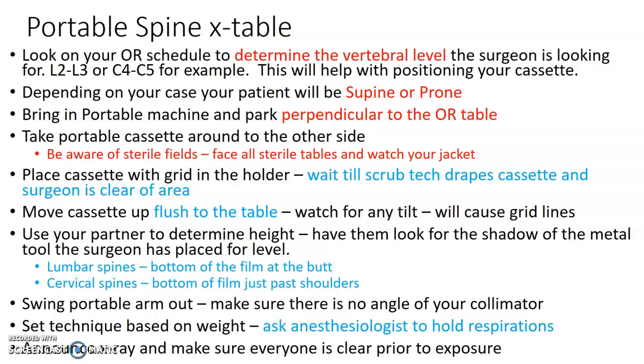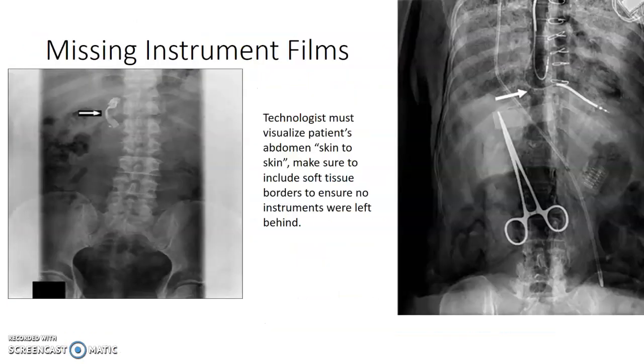So anesthesia is probably going to run out the door. The surgeon may stand behind that clear rolling lead shield. Someone may stand behind you if you have a lead on. So just be aware of that.